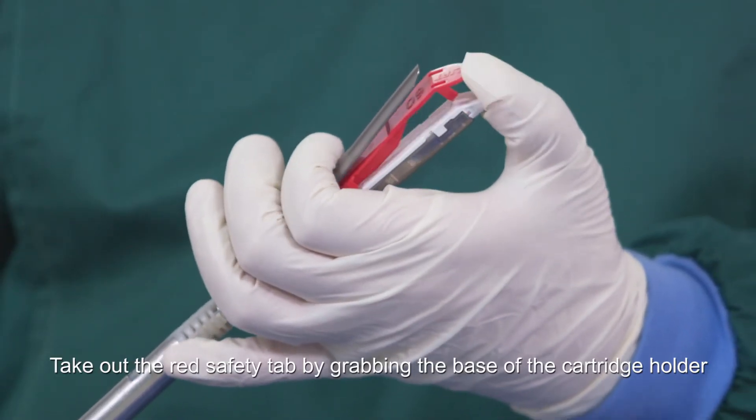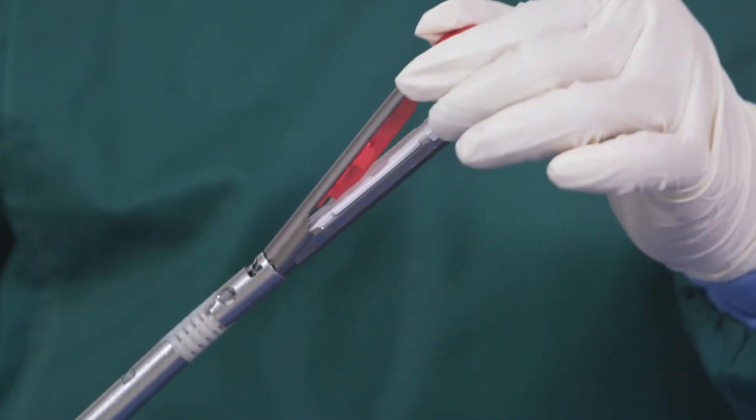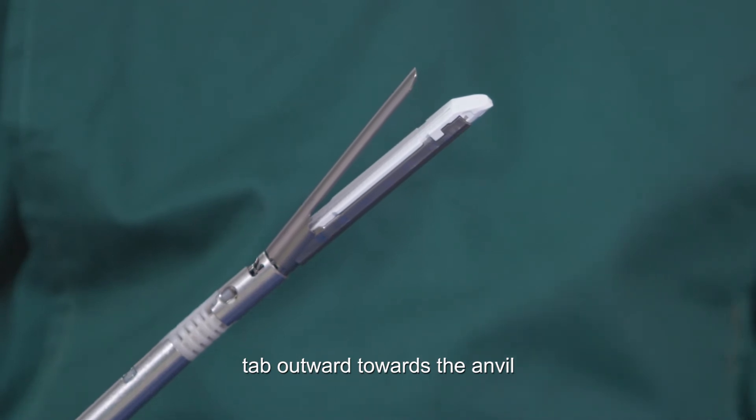Take out the red safety tab by grabbing the base of the cartridge holder, then use the thumb to push out the red safety tab outward towards the anvil.